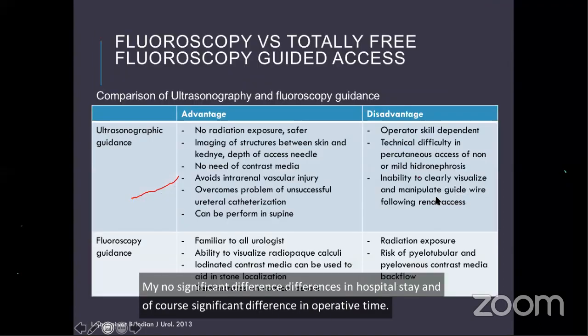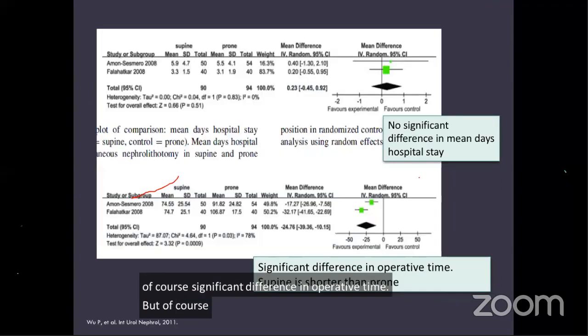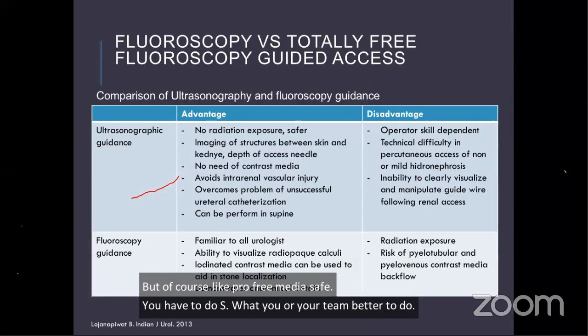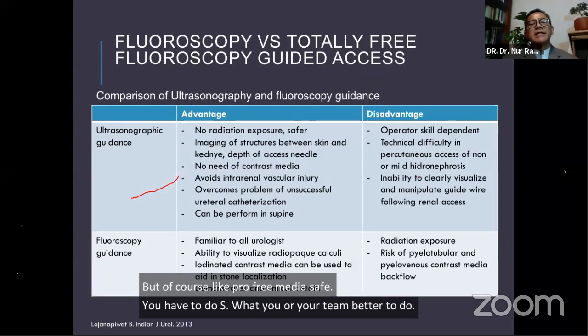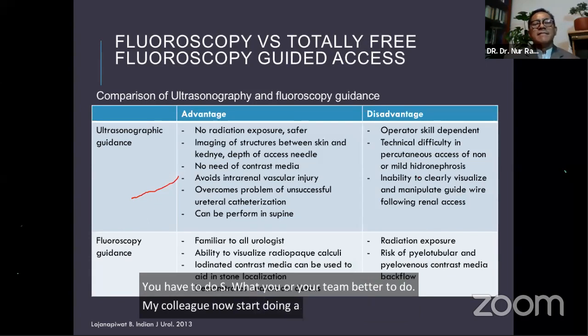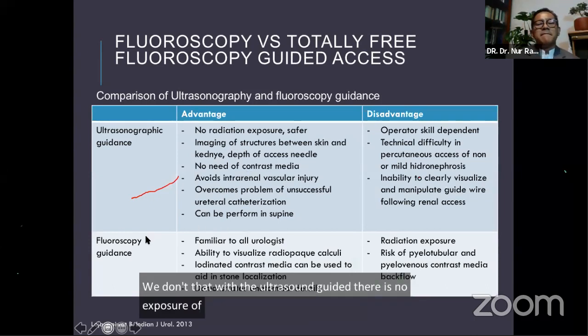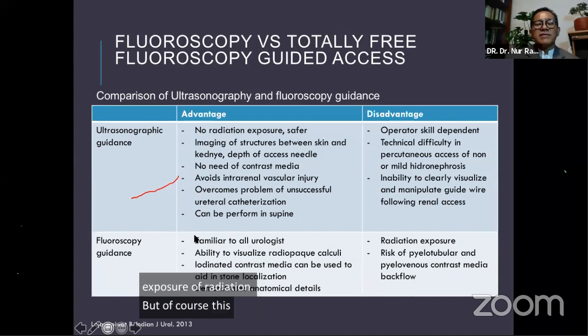But of course, like Prof. Preminger said, you have to do what you or your team are better at doing. My colleague has now started doing fluoroscopy-free. We know that with ultrasound guidance there is no radiation exposure. But of course, with ultrasound there is a disadvantage: the operator needs to be more skillful.